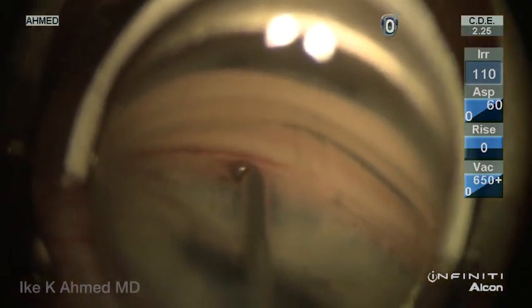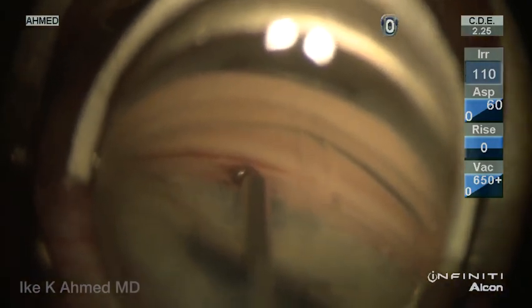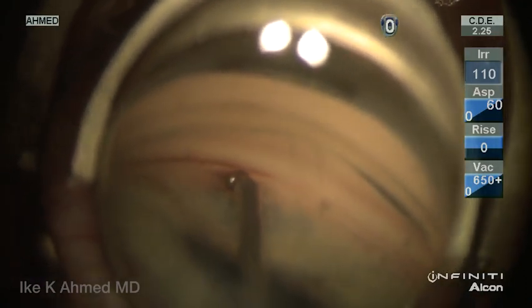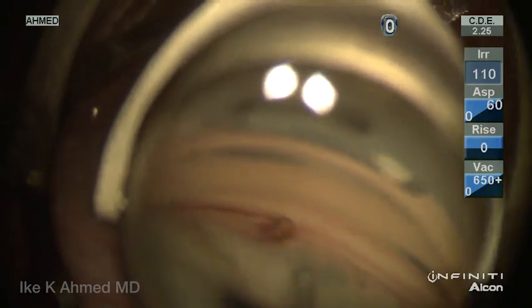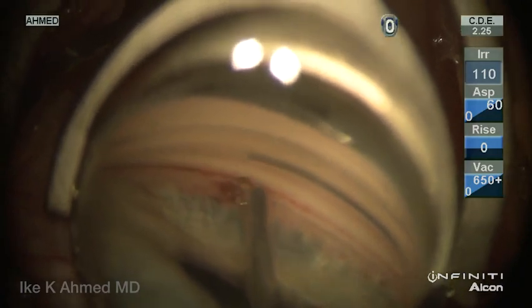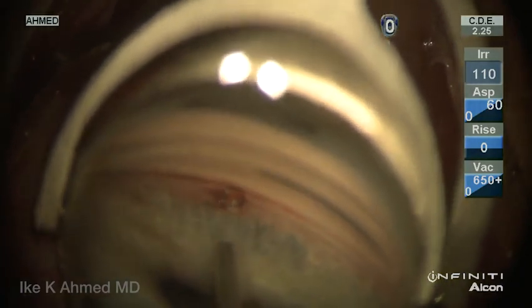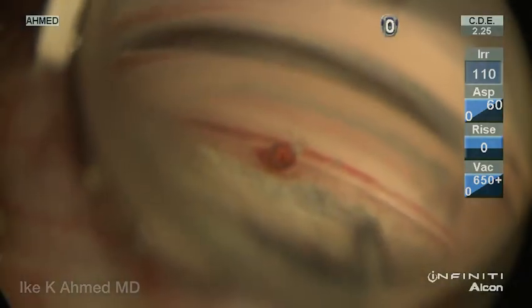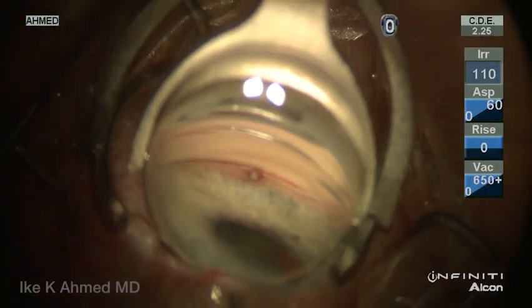Now we basically see 3 rings. We like to place the device at about the second level of the ring, and then basically watch as the cuff is released here from the guide wire, pressing the button, and now we have the stent in position. We typically like to see at least a couple of rings visible in the angle to ensure that we have adequate placement. And you see we've also positioned the device away from any angle vessels to reduce the risk of any kind of bleeding. It's well seated, and the procedure again is performed very intuitively and very efficiently.